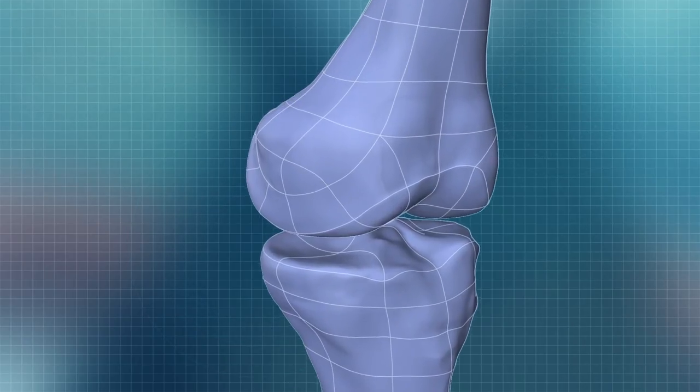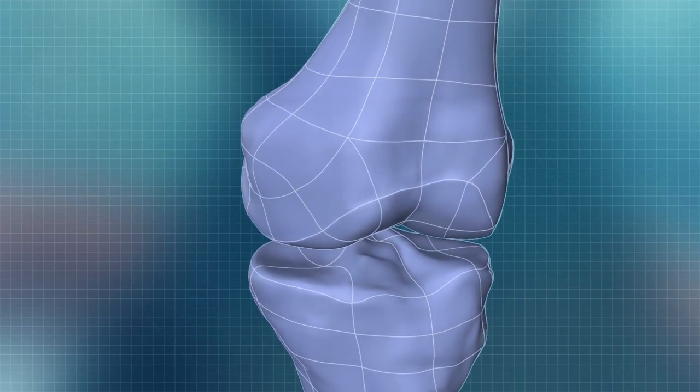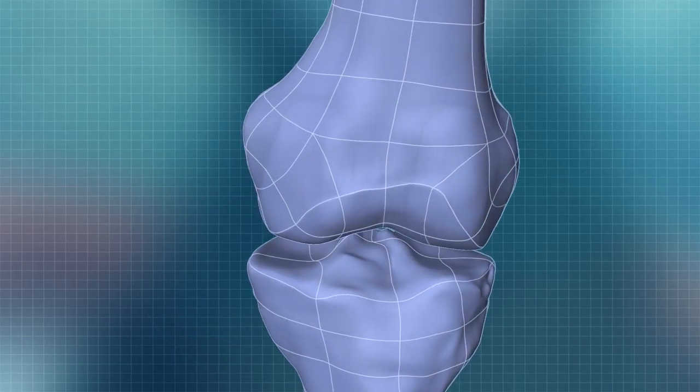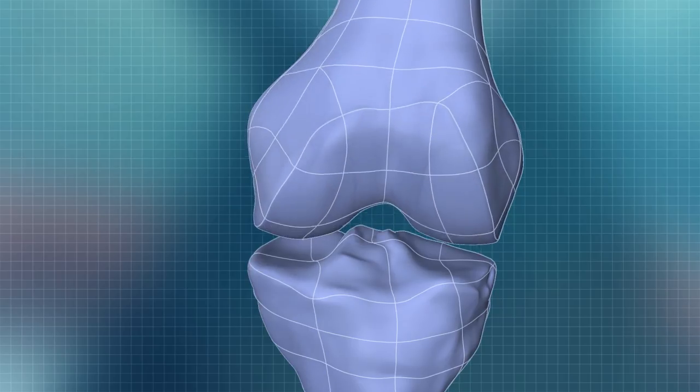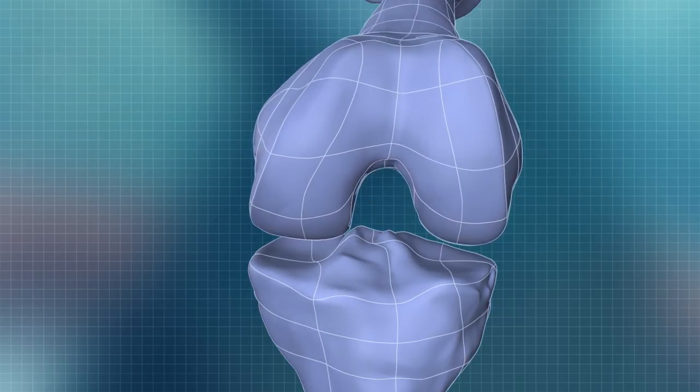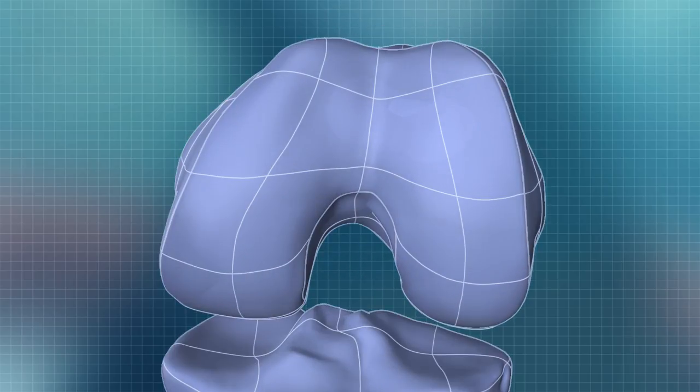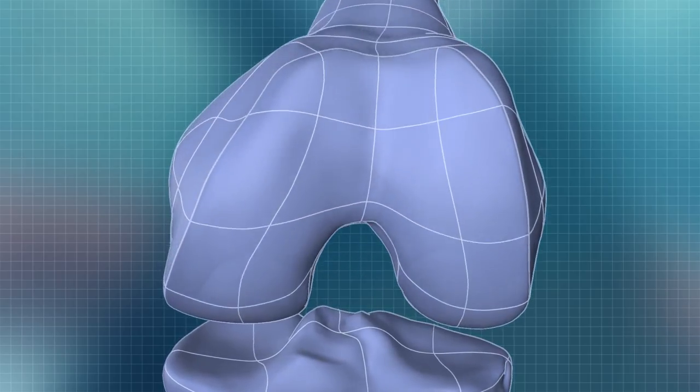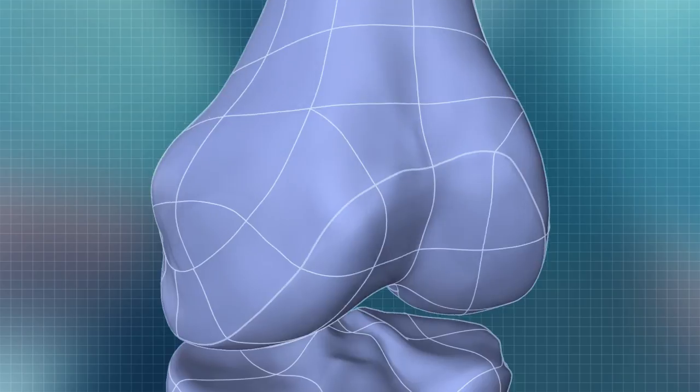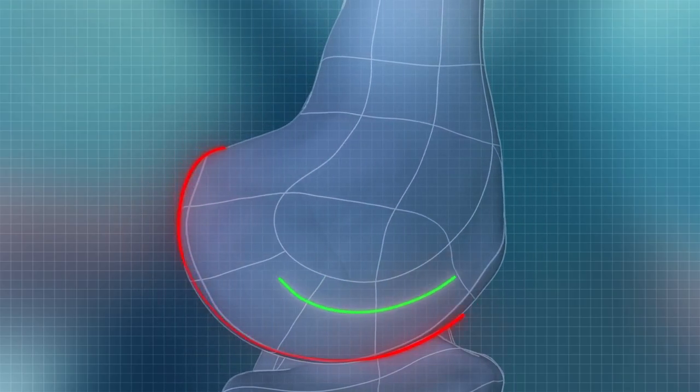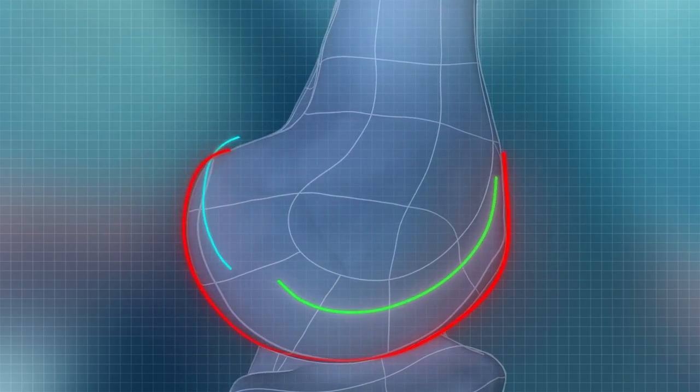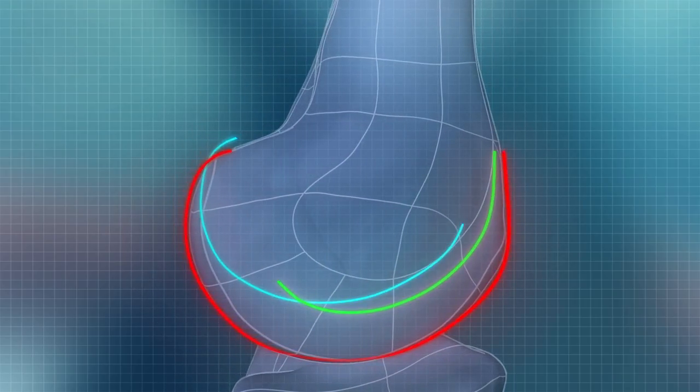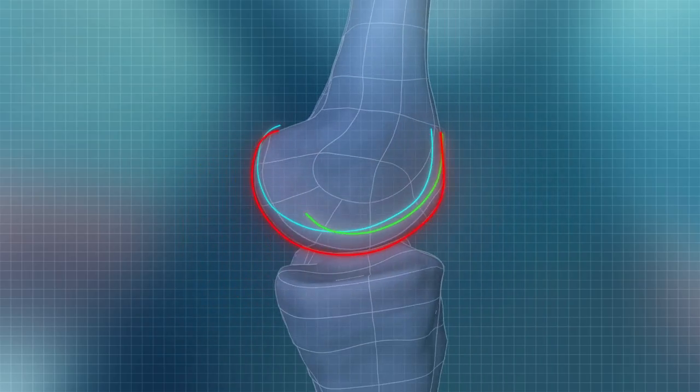In the 3D environment, iFit recreates the patient's natural J-curves, corrected for deformity. From the 3D model of the patient's knee, iFit software builds the femoral and tibial implants to match the unique size and shape of each knee.